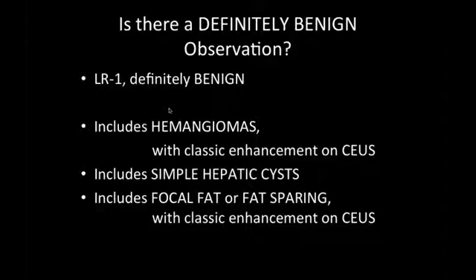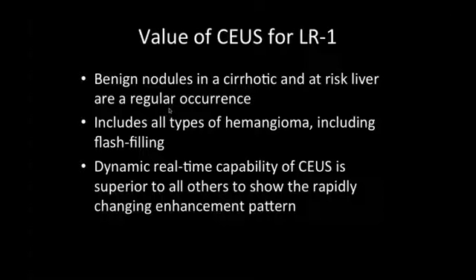This allows us to extract images from our movie at these time intervals, and you can see that this lesion has classic arterial phase enhancement for hemangioma with peripheral nodules and centripetal progression. It's uniformly enhanced at 1 minute and shows sustained enhancement at 4 minutes. So this is a classic flash-filling hemangioma. This is an LR1 lesion, and for this lesion, we have completed our investigation for this study.